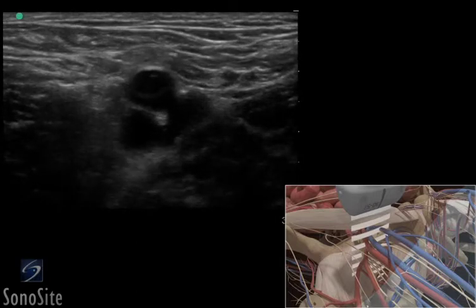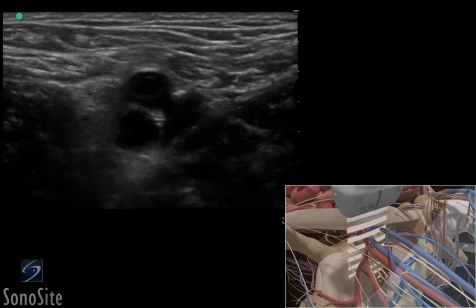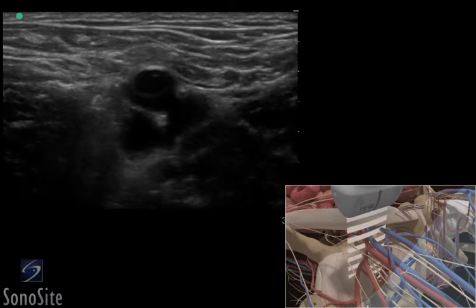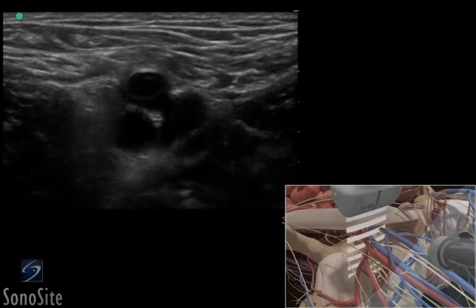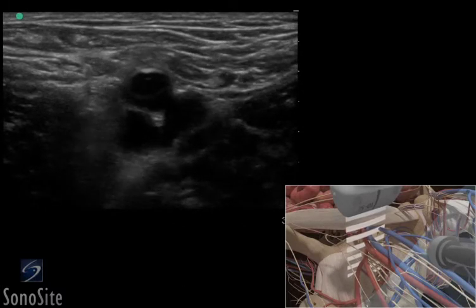Adjust the transducer so it is centered over the femoral artery, lateral to the vein. Follow the needle entry by slowly sliding the transducer in the direction of needle advancement. The needle will appear as a small bright dot.